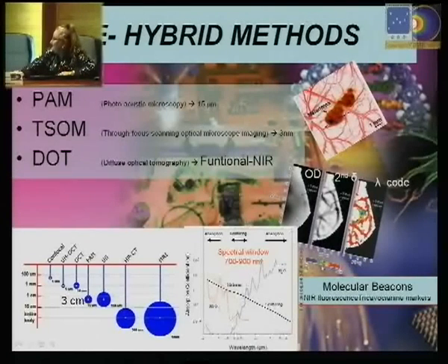When you code the 4 wavelengths, there are only 4 colors in here, you get details which are not seen in normal mammographies. And this is a cancer in this area of less than 5 millimeters of diameter.